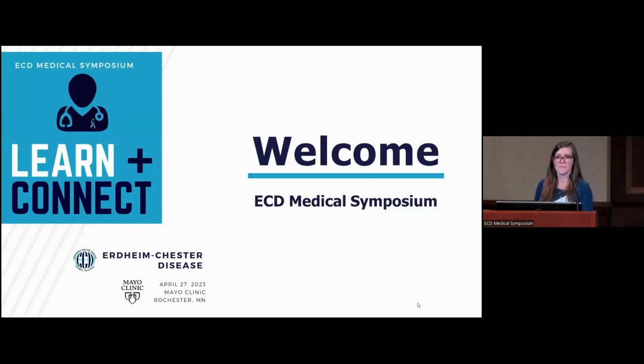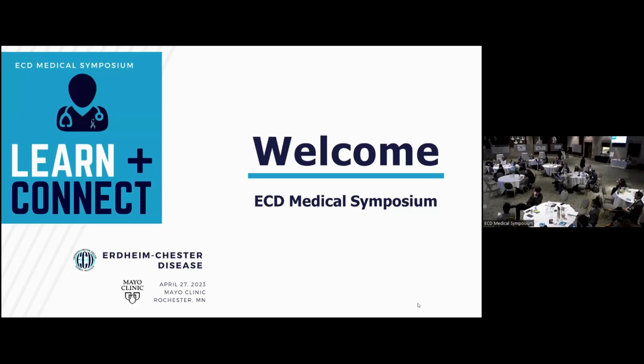If I can ask a question, in your experience reviewing PET CTs for ECD patients longitudinally, do you have any sense of sites that are more likely to resolve as opposed to not? In my informal experience, to the extent that I spy on the PET CT reports, I feel like the orbit improves but doesn't resolve, it can be stubborn, and maybe sometimes bone lesions don't resolve, whereas perinephric ones do.